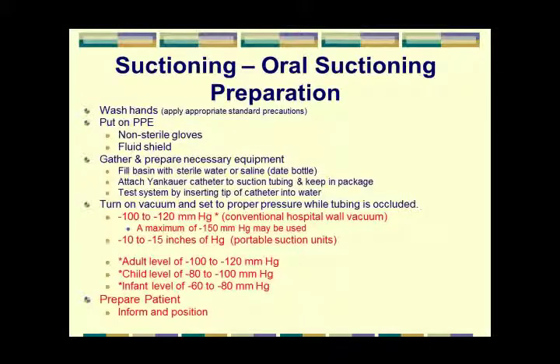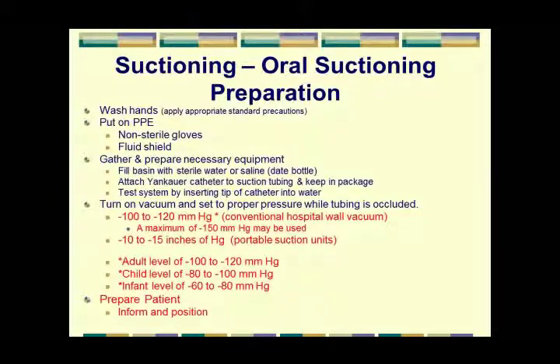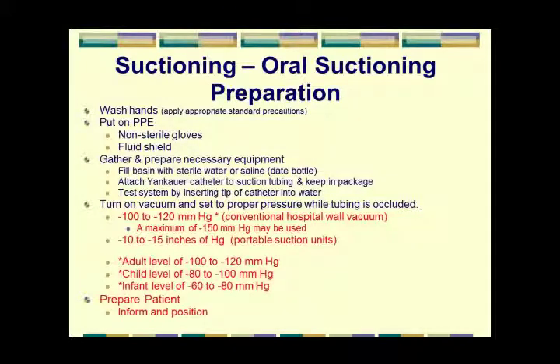Some of them are in inches of mercury, just to make life miserable, and the values there are 10 to 15 inches of mercury. That's some of the portable units we'll end up having. Okay. So once I have the proper level of vacuum applied, I have my suction catheter attached. I've verified its function by putting the tip of the Yankauer into some water.